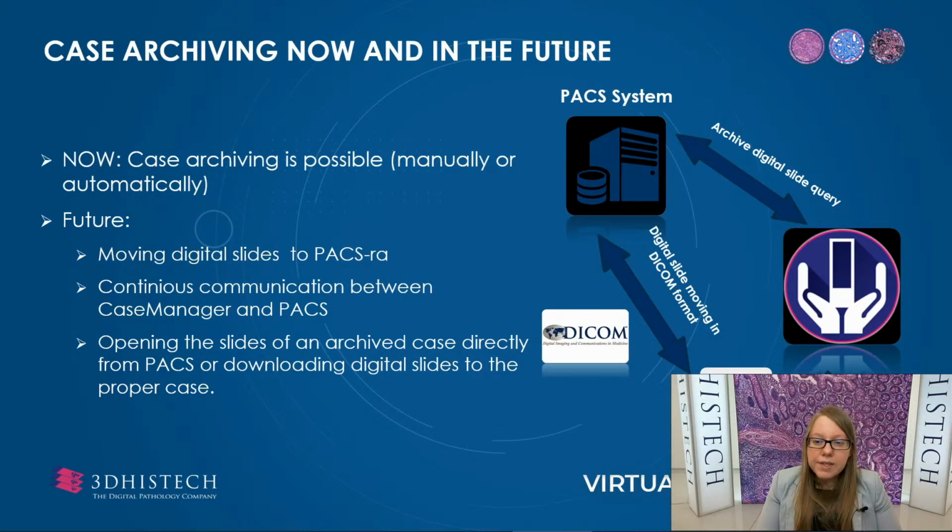Currently, it is possible to archive a case manually or automatically. The list of the archived cases is separated in a way that helps to reduce the interruption during the daily work. In the future, the PACS system will be responsible for archiving the digital slides. PACS is short for Picture Archiving and Communication System, which is an image storing and distributing system with the DICOM formats and protocols.